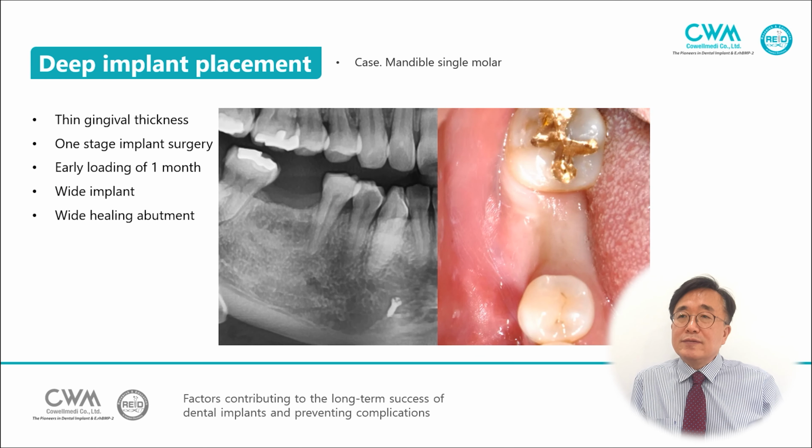So in this case, the buccal gingiva is reflected, and the thickness is 2 millimeter.